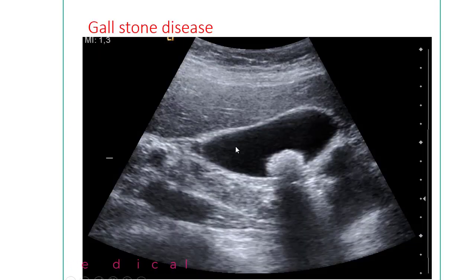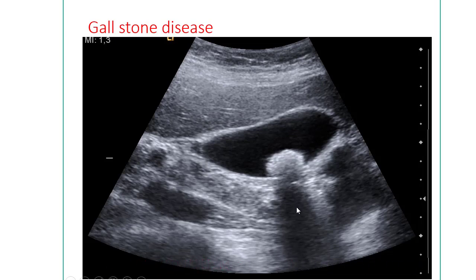This is another very common disease identifiable by ultrasonography: gallstones. This is the gallbladder, and this is the stone. A stone shows a posterior acoustic shadow, which is very important in ultrasonography. When an ultrasound wave passes through a hard structure, the area behind it displays a posterior acoustic shadow — an important diagnostic tool for stone disease.